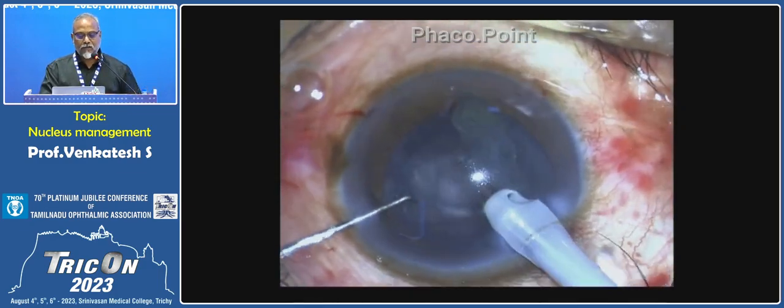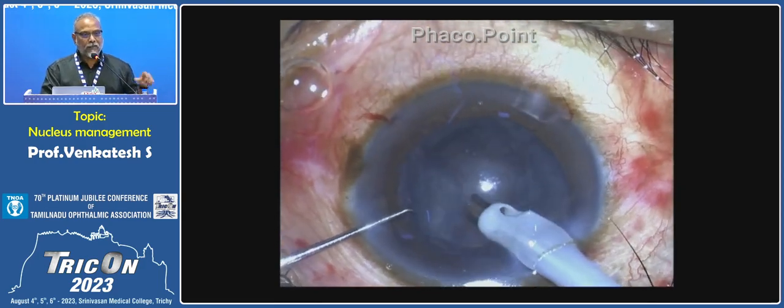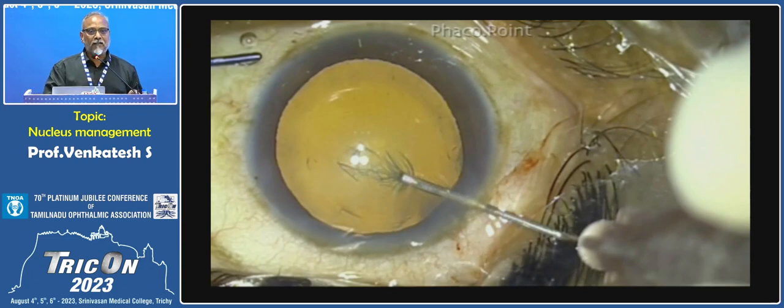We know that with the use of premium IOLs, we need to have a good overlap of the optic with the rexis. So a 5 or a 5.25 millimeter rexis is the ideal rexis, because when you get the overlap, you'll get the effective lens position. You'll also have PCO formation will be less. But if you aim for a large rexis, the decentration, the tilt, the torque, et cetera, will occur over a period of time as the capsule undergoes fibrosis.